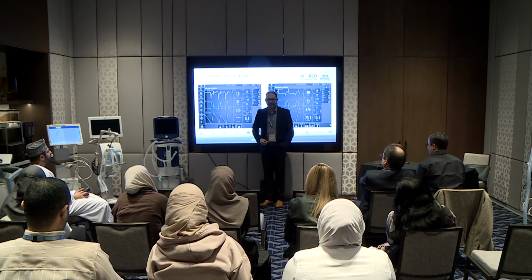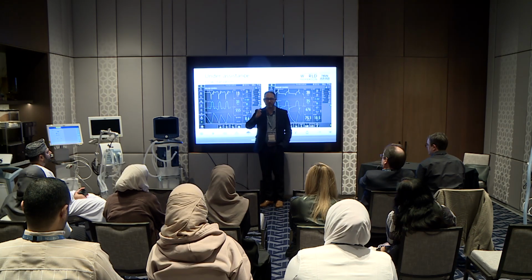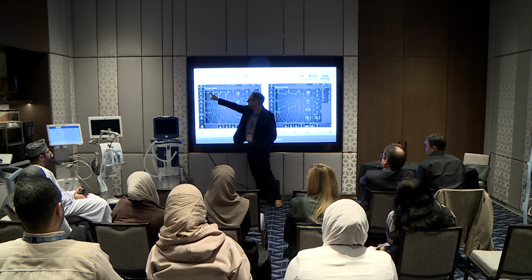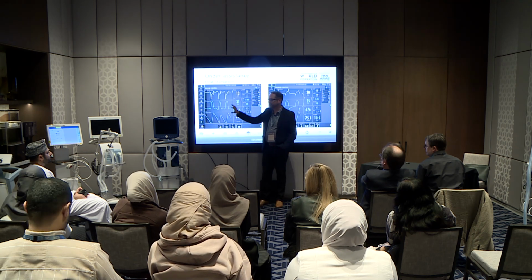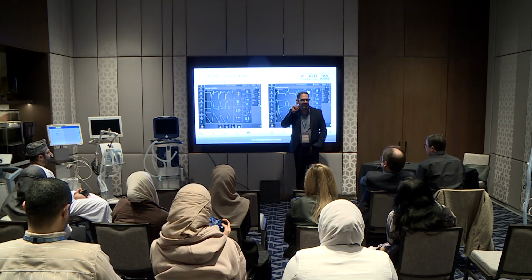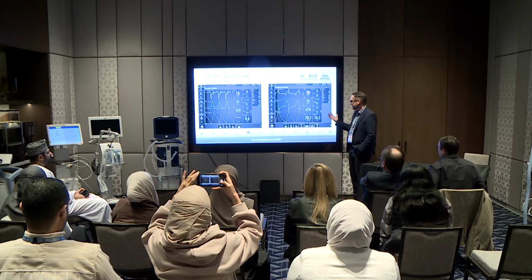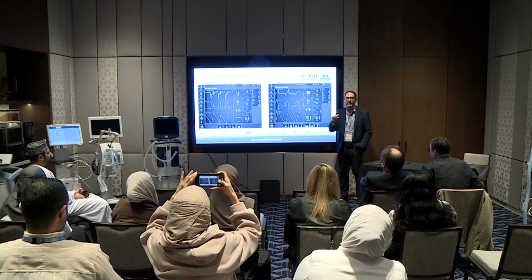This ventilator, if you pull hard enough, the default setting of this ventilator is to allow you, it almost gives you like a pressure support breath. That's why the flow is round. But this is PEEP, by the way. This is inspiration. Look at how low the pressure is dropping. This is flow starvation. When you see this, what do you do immediately? Switch to a pressure targeted mode, please, thank you. Now, we did that. The patient's breathing 10 mils per kilo, and that's on a pressure control of 6.